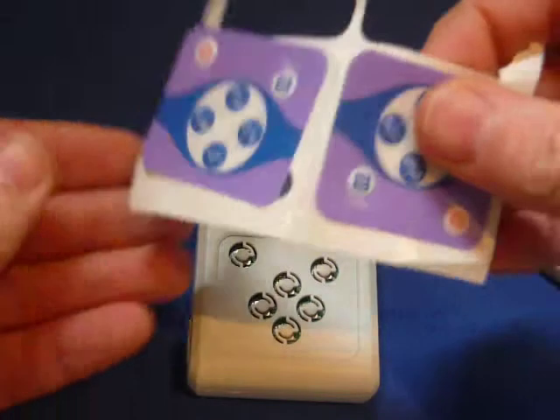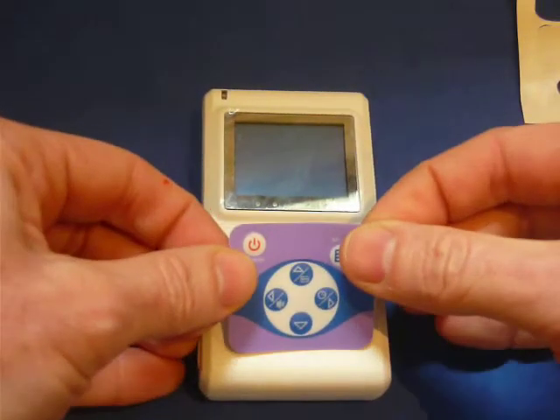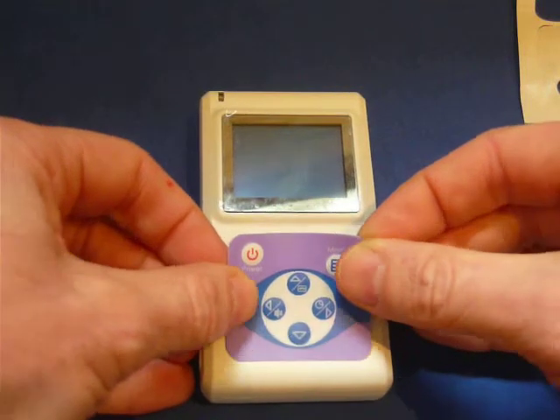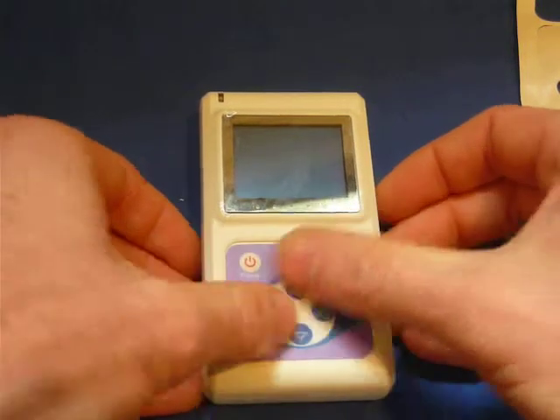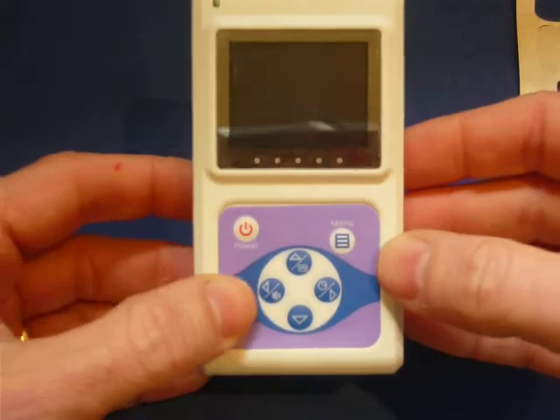Here's the new label. Let's peel it off and stick it down. Let's do this again.